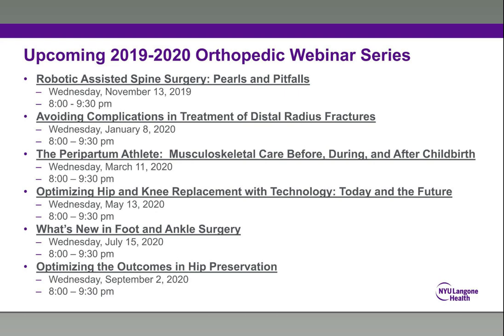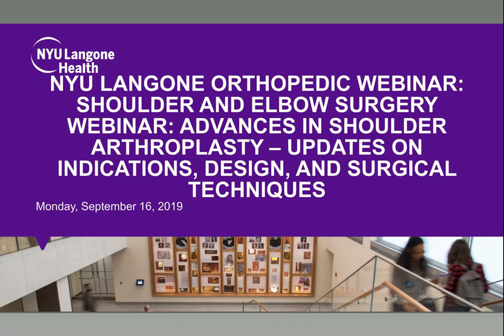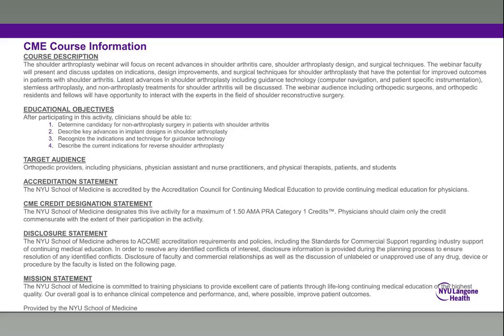70 to 75, I follow Dr. Kwon's guidelines. I look carefully at it. If the rotator cuff is intact and it's good, then I'm going to do an anatomic. And below the age of 70, in the absence of other mitigating factors, soft tissue or significant bone erosion, they're going to get an anatomic. Keep in mind, these are still somewhat guidelines, except for the over 80. As I said, I think I'm pretty rigid on that.